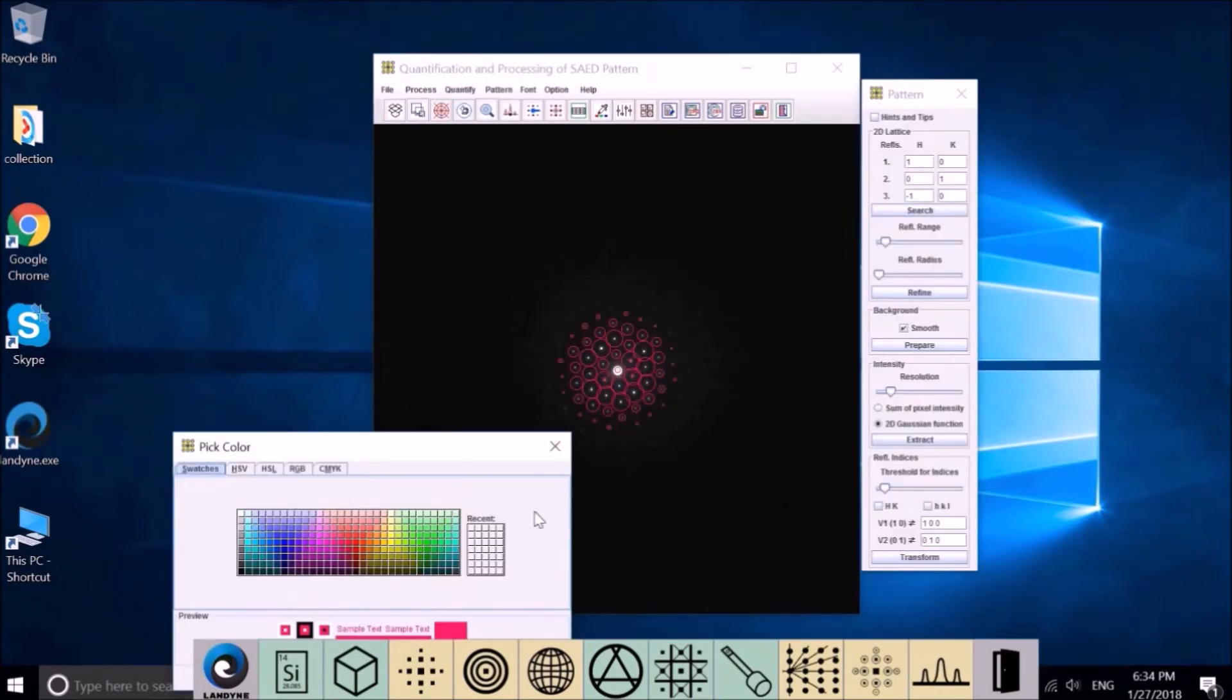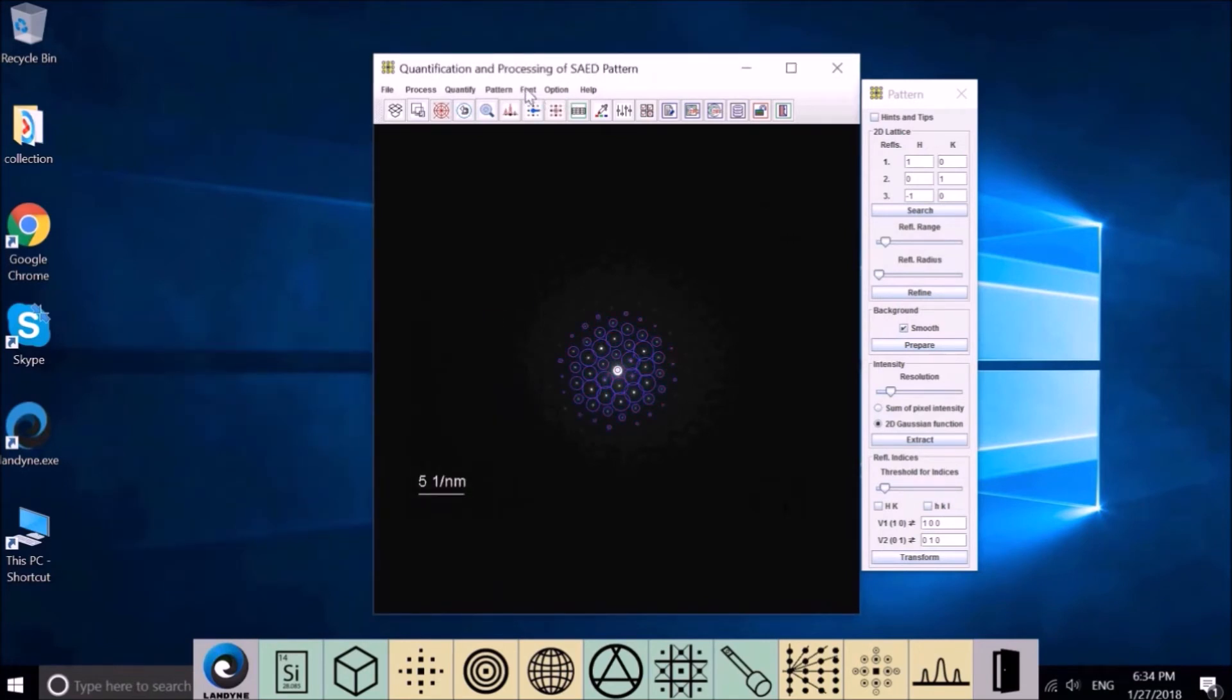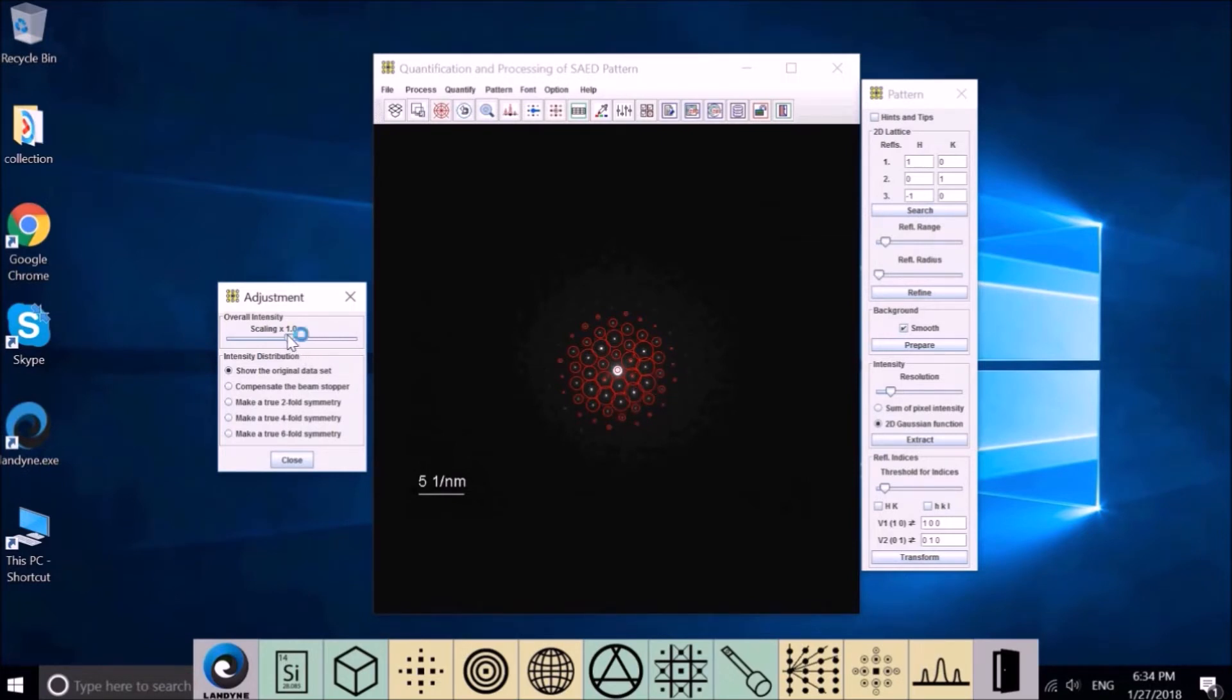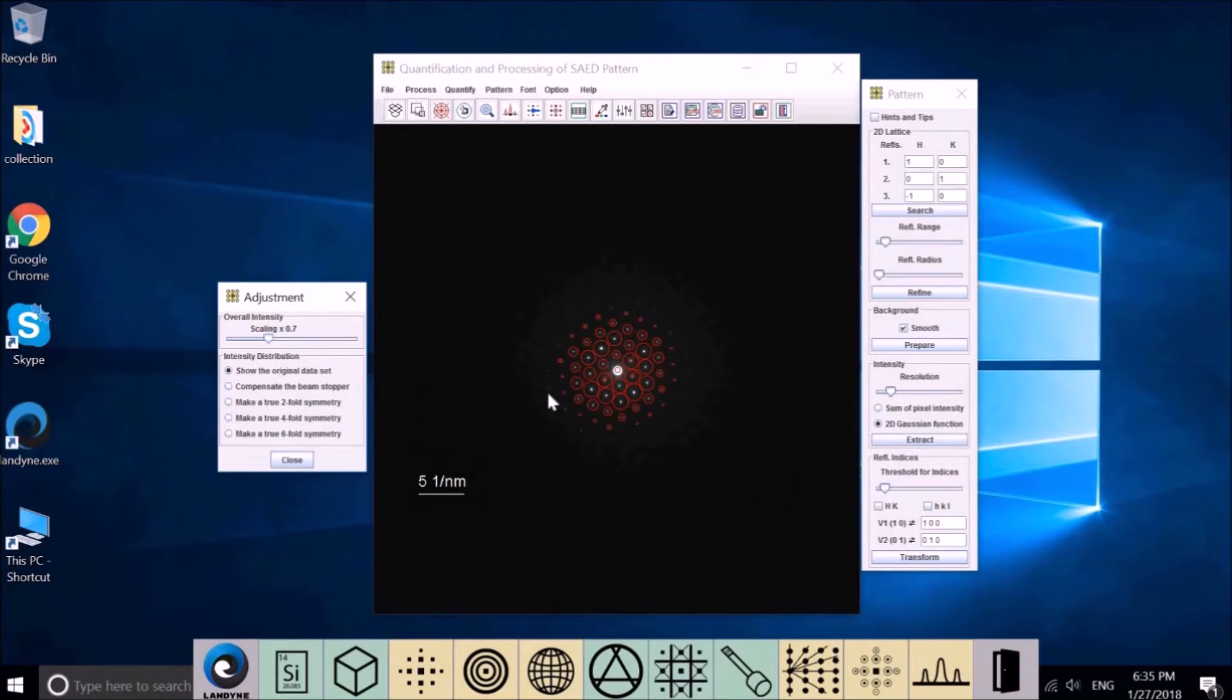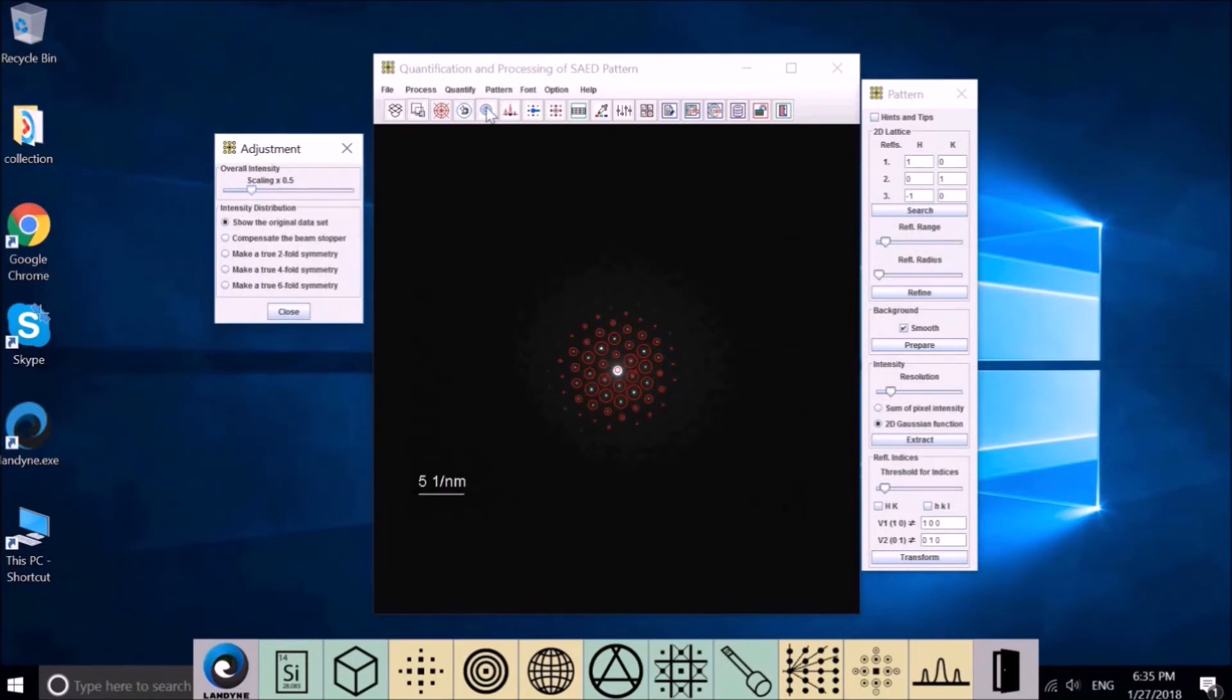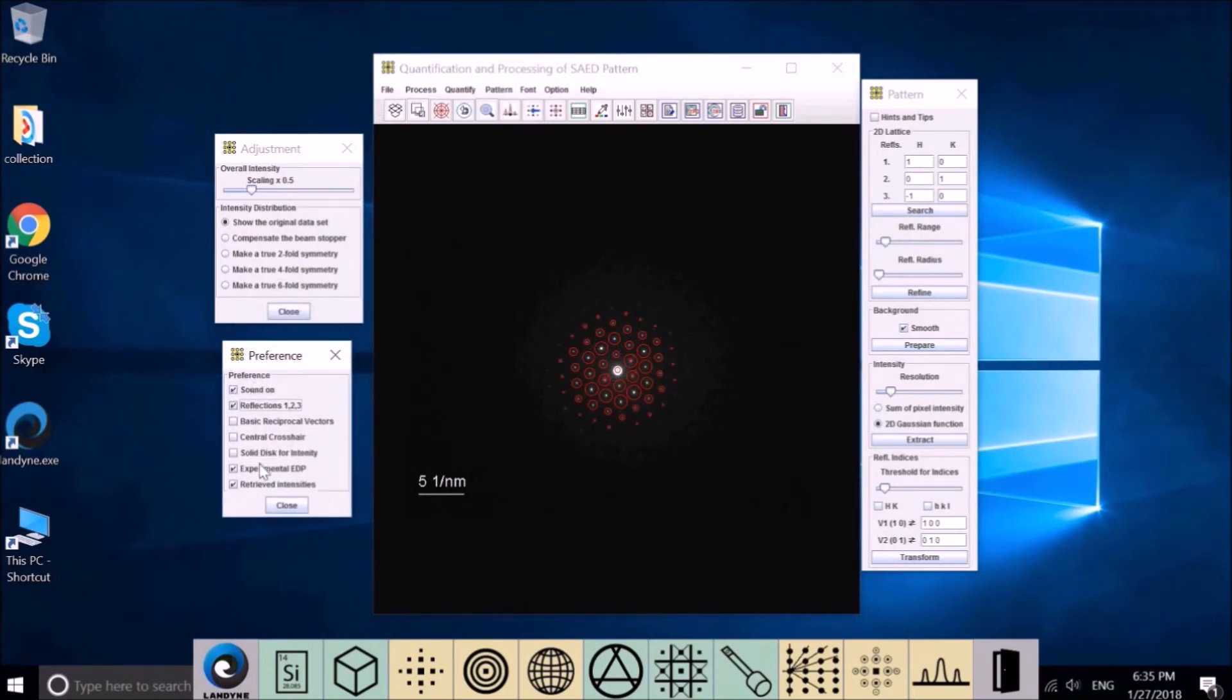Let me introduce the function in Pattern. The first one, we can choose any color to represent the retrieved intensity. Next one is for the adjustment. The first adjustment is to adjust the overall scaling factor for the whole intensity. Some of the circles are overlapped, so let's reduce this one a little bit. This will not change the original data we retrieved, only for display purposes.